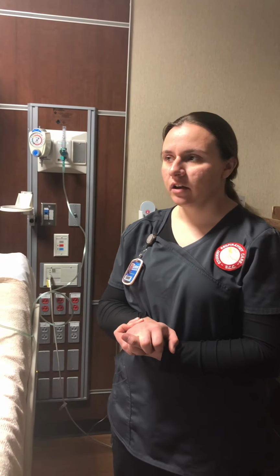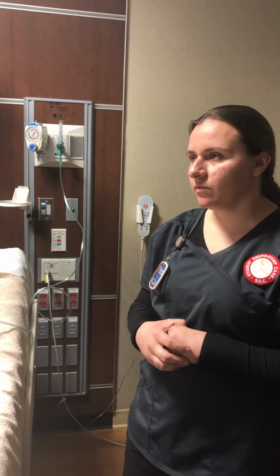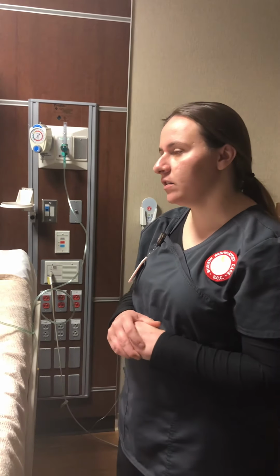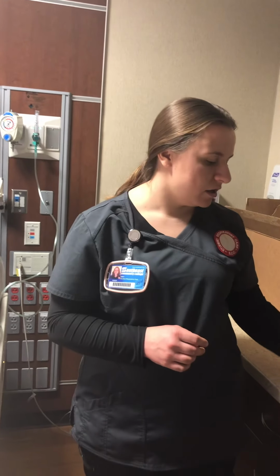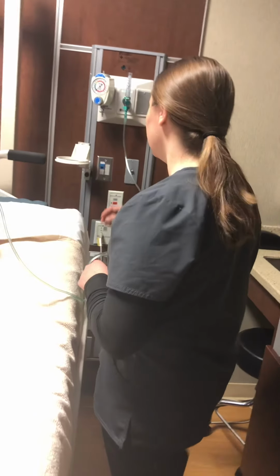So I come back, and the doctor later on had performed another ABG just to make sure it is the appropriate device that we had chosen, and they noticed that the levels are going back to normal. After they have been on it for a little while, the doctor would like to start to wean them off, and so they had lowered the flow, and I'm going to change them to nasal cannula, and that way they can begin to be weaned off the oxygen.